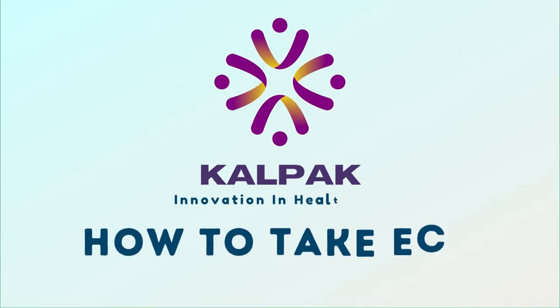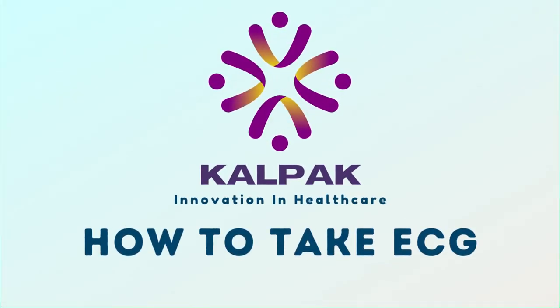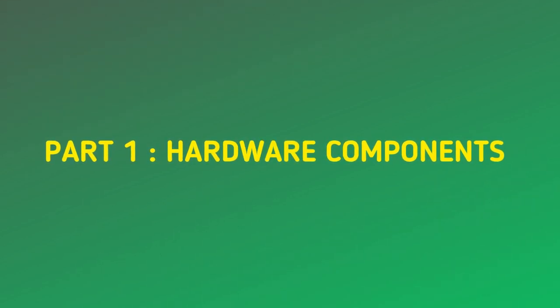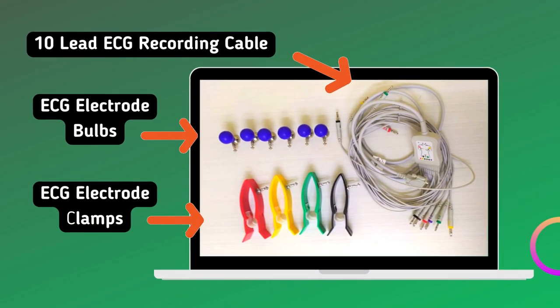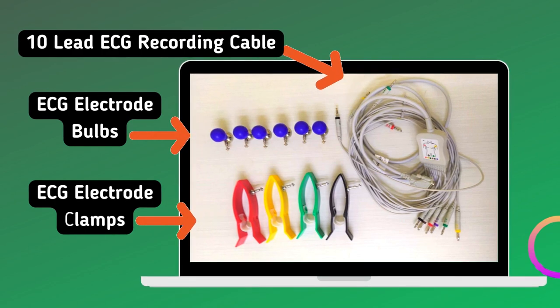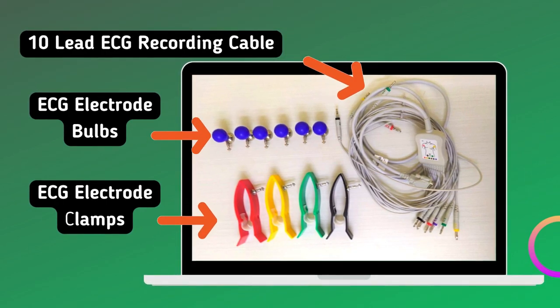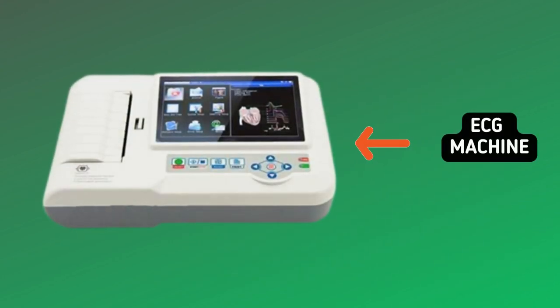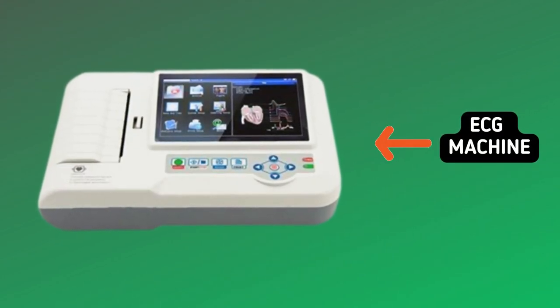How to take ECG. These are 10 lead ECG recording cable, ECG electrode bulbs, and ECG electrode clamps. The ECG machine will look like this.